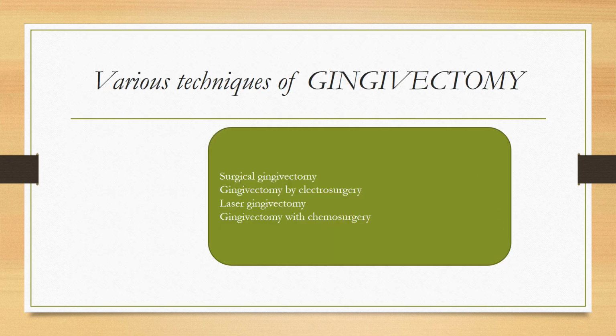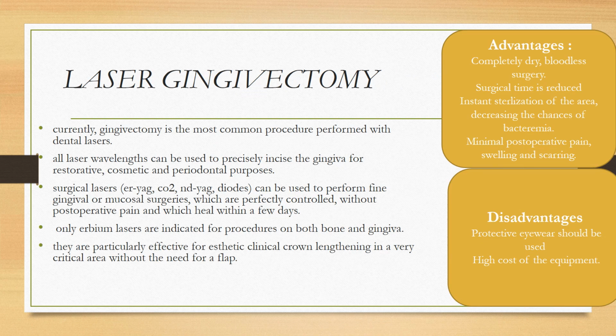So, various other techniques of gingivectomy, as we told before: this procedure can be done by scalpel, electrocautery, laser, or with chemosurgery. Out of that, the most important one is the laser gingivectomy that we are following here. Currently, gingivectomy is the most common procedure performed with lasers.